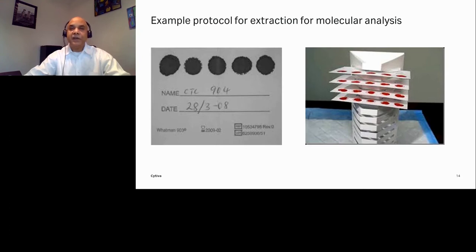The DBS represents a low infectious hazard, as some viruses such as HIV 1 and 2, human T-cell leukemia virus 1 and 2, and hepatitis C virus are known to be present in serum or plasma, but they lose infectivity due to disruption of their envelope during the drying process. However, virus in high titer may remain viable on a surface for several days, and hepatitis B virus may remain infectious for at least 7 days.